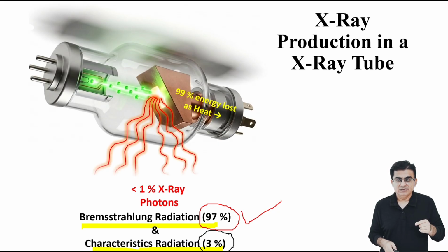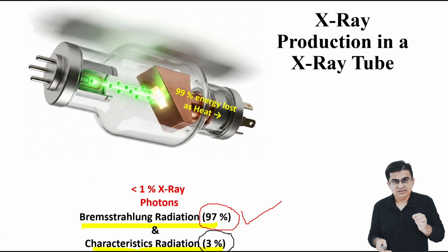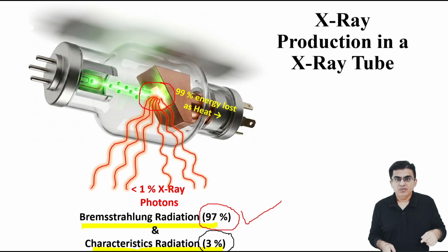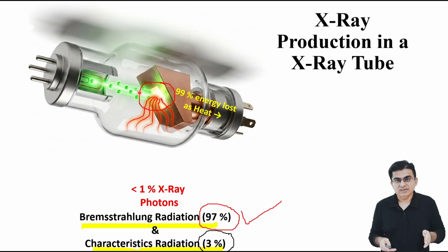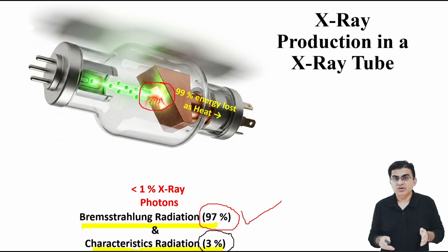In our next class, we will look at the exact moment the electron strikes the tungsten atom here. We will learn how a high-speed electron interaction near the nucleus provides Bremsstrahlung radiation. We will also learn how the ejection of an inner shell electron produces characteristic radiation. Understanding these two physical processes is essential for your understanding of radiation physics. I encourage you to understand today's class on the X-ray tube before our next class.